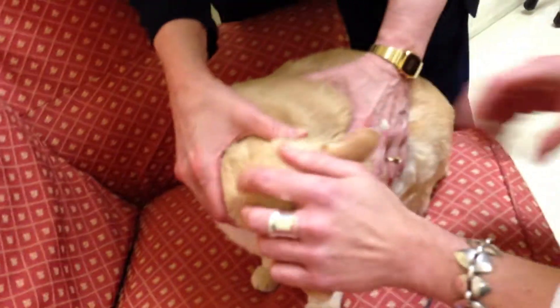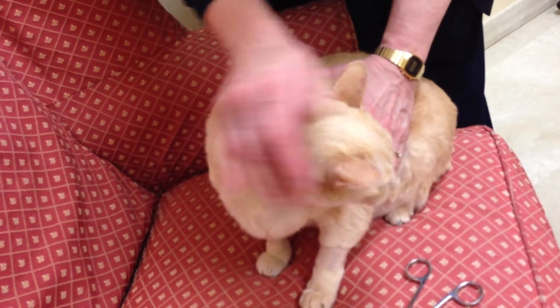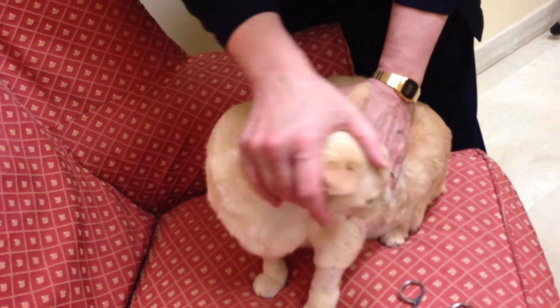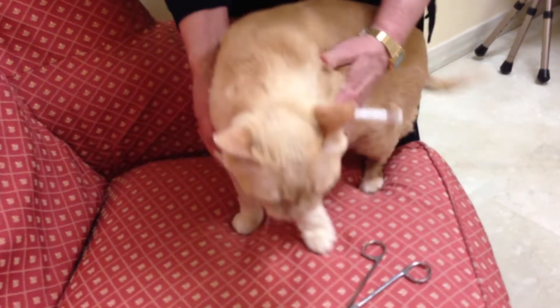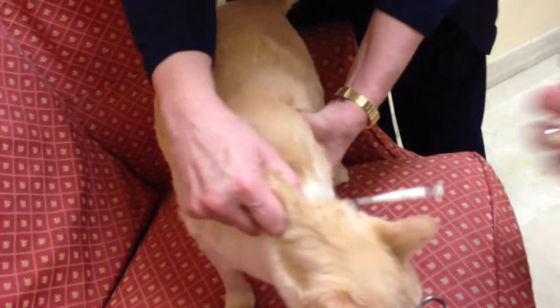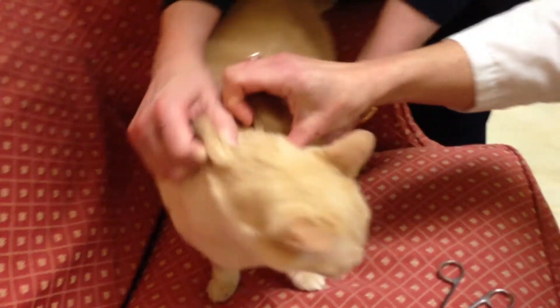Get that last little bit out. We're going to get it out of here. Okay, buddy. Drum roll. One, two, three. All out.